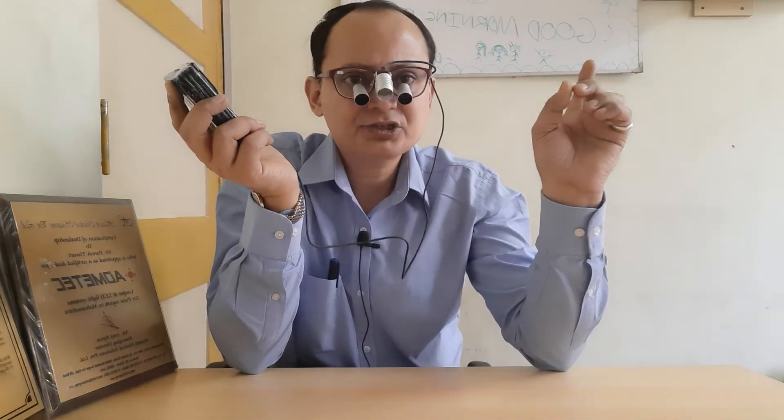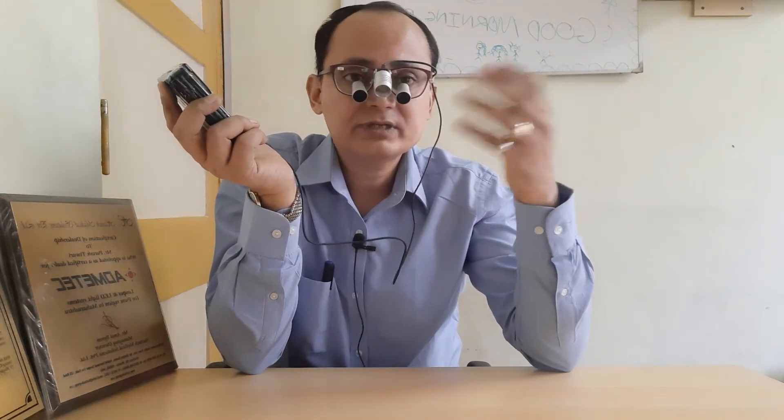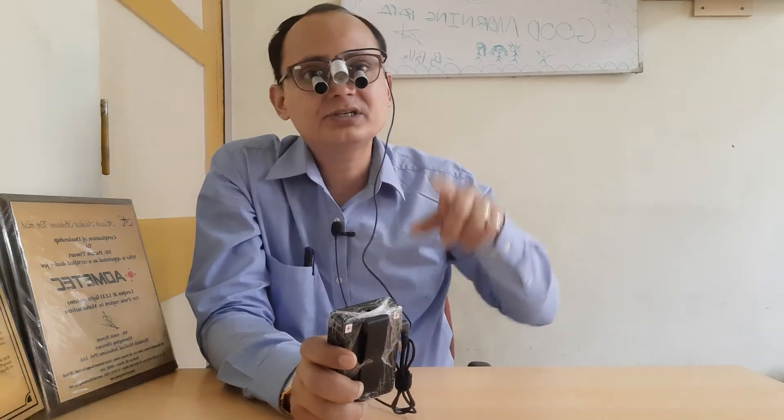This battery has a backup time of 6 hours plus — it has a rated capacity of lasting 6 hours at a stretch when used at full illumination. If you are using a different illumination level, the backup time may go up slightly. The battery also has a life of 500 recharge cycles, meaning this battery can be charged and discharged 500 times.